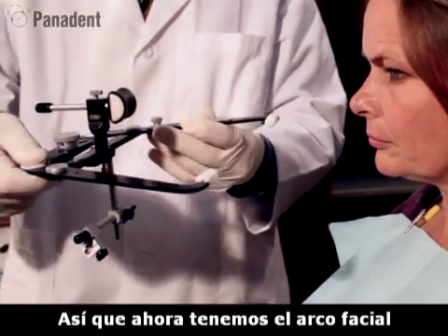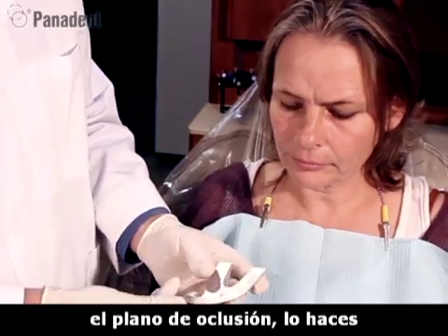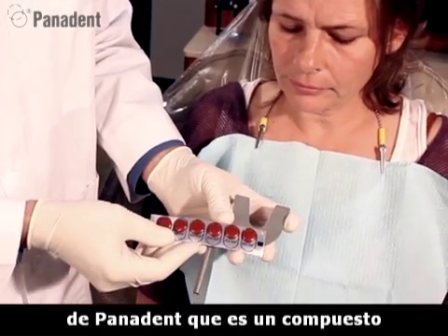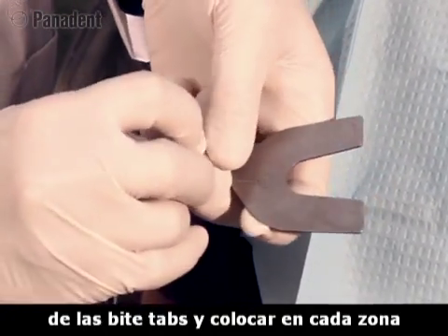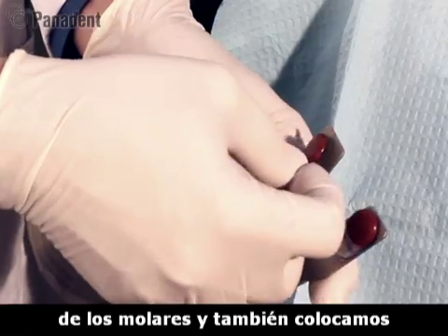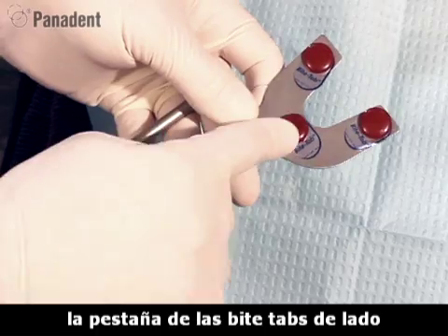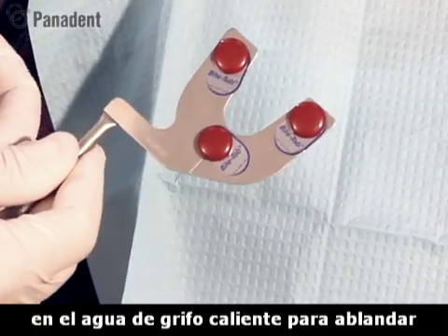Now we have the face bow ready for patient use. Next we'll get the plane of occlusion using a bite fork, which has a dental midline mark. We can use either wax or bite registration material, but we also developed a Panadent bite tab — a red impression compound on a self-adhesive strip. You simply peel a corner of the bite tab off the paper and stick it over each molar area, and also place one in the anterior area for the incisor. I like to place the bite tab sideways in that spot so I don't cover up the midline line.